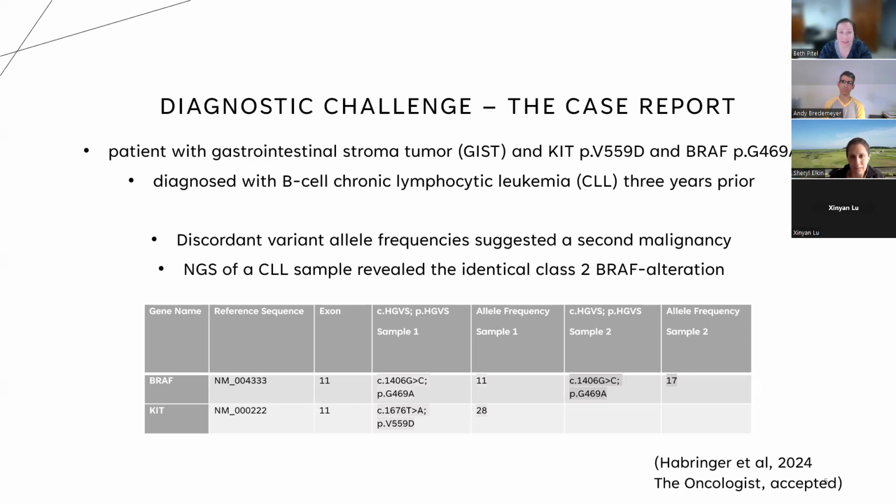Yeah, it's tricky, right? Every panel is different. Sometimes it depends on whether you have extracted DNA or RNA left to run something and not have to go through an extraction process. There's a lot of that, but I think it's also within our practice to give a preliminary report under lab director discretion.